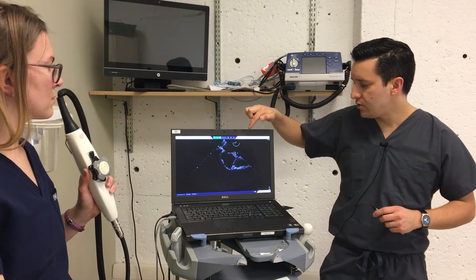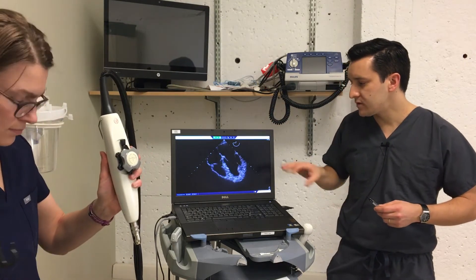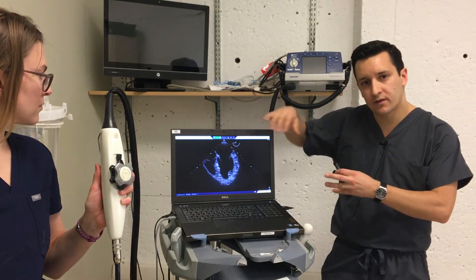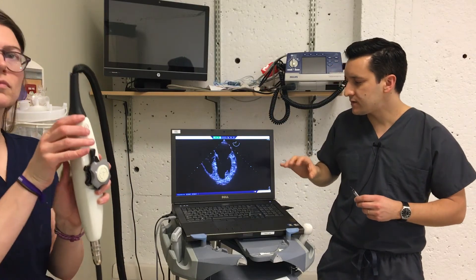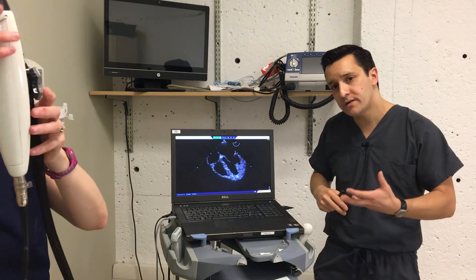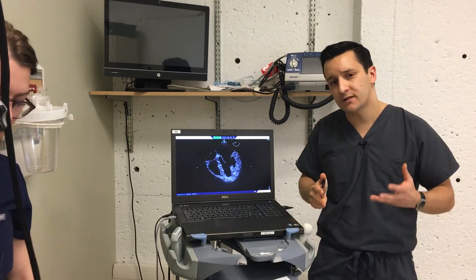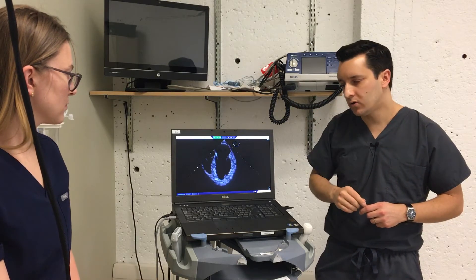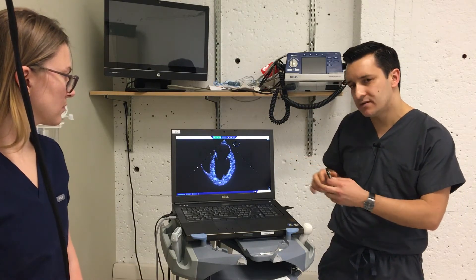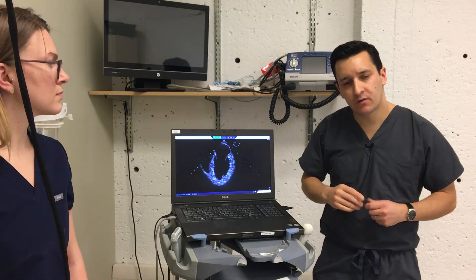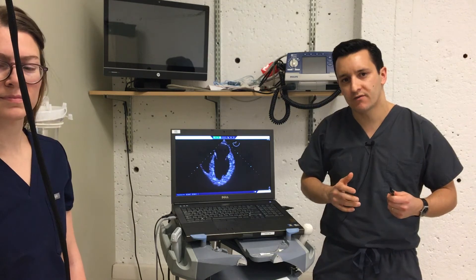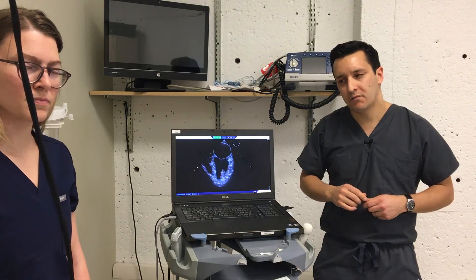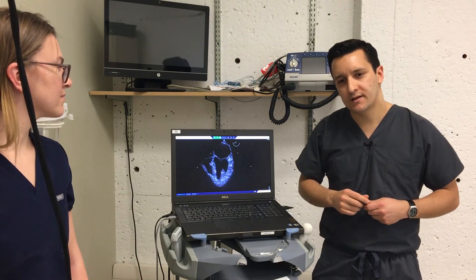From this view, we go back to our four-chamber view. Commonly at this point, we leave the probe inserted with omniplane at zero, showing the four-chamber view, which serves as a continuous and dynamic window to the heart available to the whole resuscitation team. We will commonly hang the probe from an IV pole or similar and maintain this image as an additional monitor. With that, we conclude the demonstration of this four-view protocol. On behalf of the Resuscitative TEE project and my colleagues at University of Pennsylvania, I say goodbye.